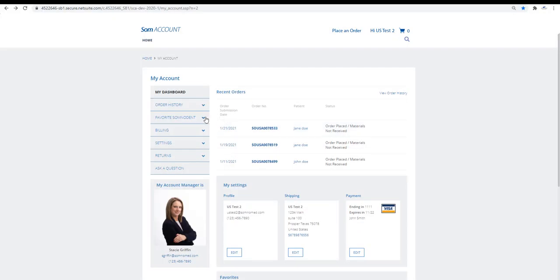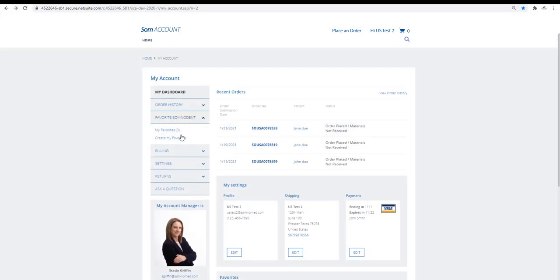On your SOM account panel, click the Favorite Somnodent tab. Select Create My Favorites.